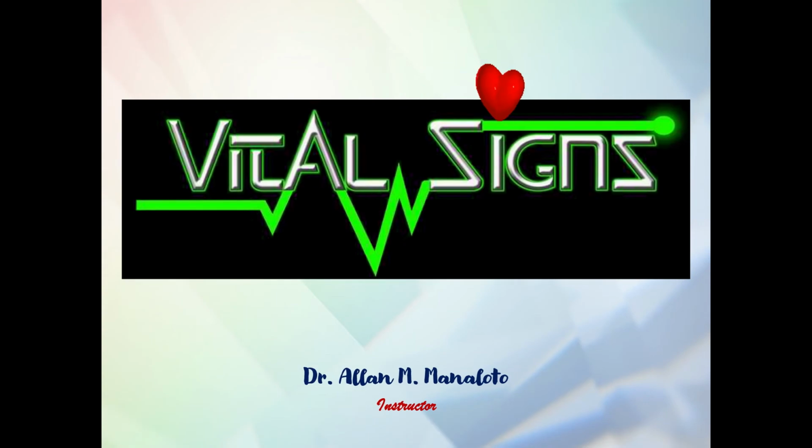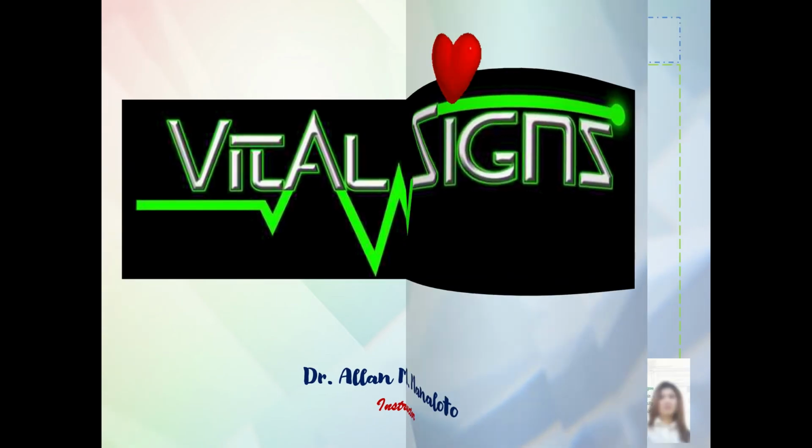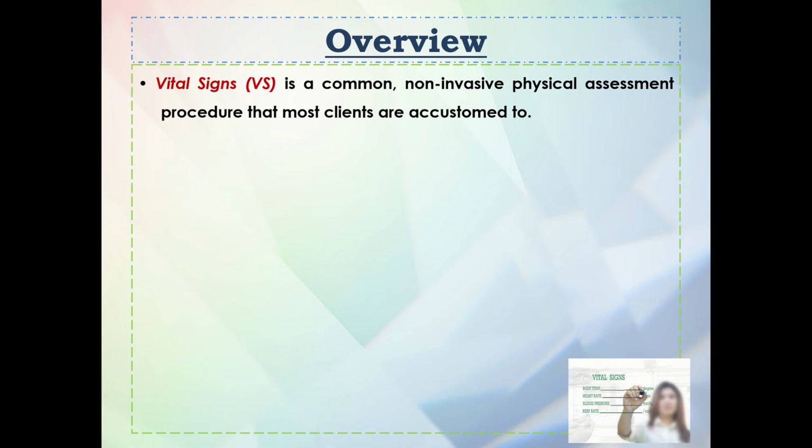For today's topic, I am going to discuss the vital signs. For the overview, vital signs is a common, non-invasive physical assessment procedure that most clients are accustomed to. So pag sinabing vital signs, we have five components. You have the temperature, you have the pulse rate, respiratory rate, blood pressure, and pain or pain assessment.